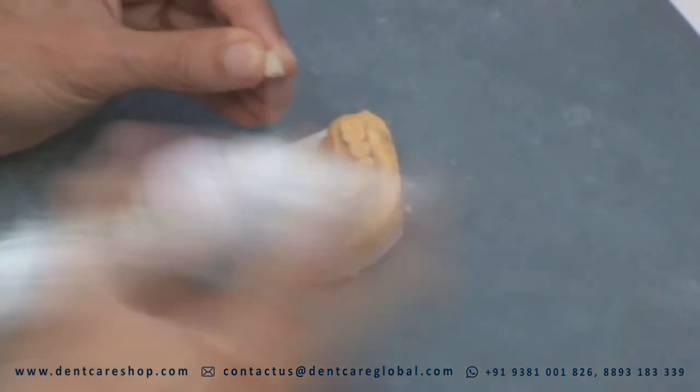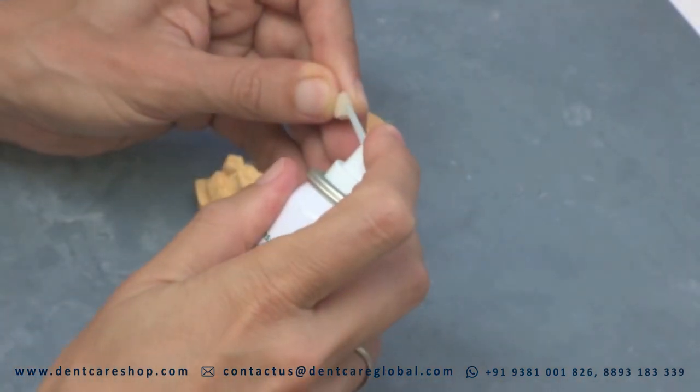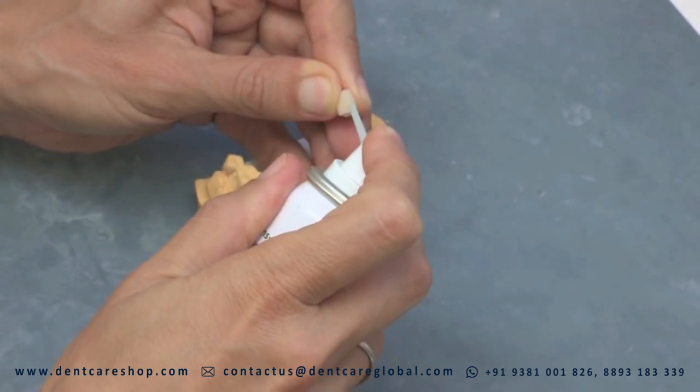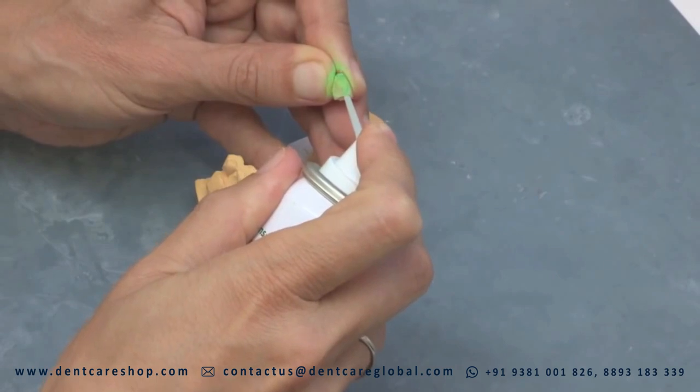Apply at a distance of 3 to 5 cm onto the occlusal surface or inside the bridge or crown. When testing occlusion or trial seating the bridge or crown, all contact points will be immediately visible.